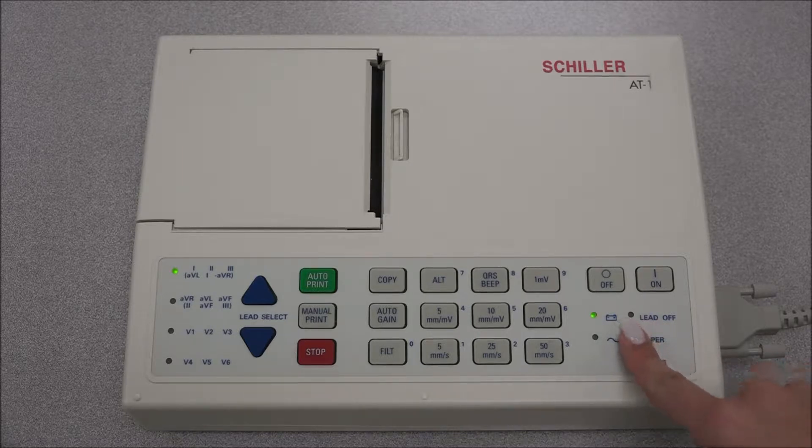The lead off light notifies us when one of the leads is off or improperly located. The paper light will turn on when there is a block in the printer or the paper is running low. The filter light turns on when the myogram filter is activated.